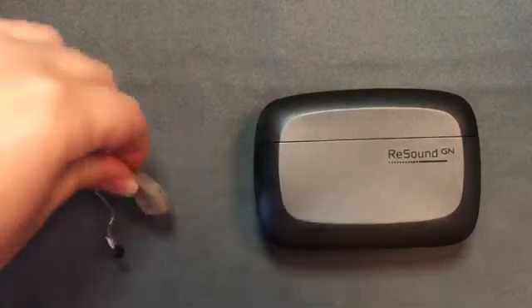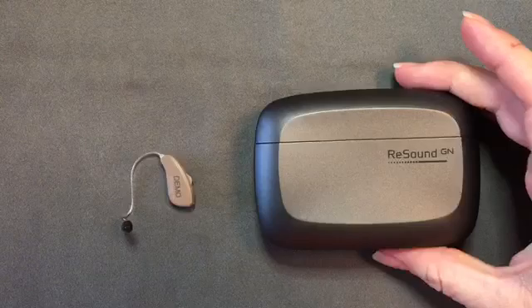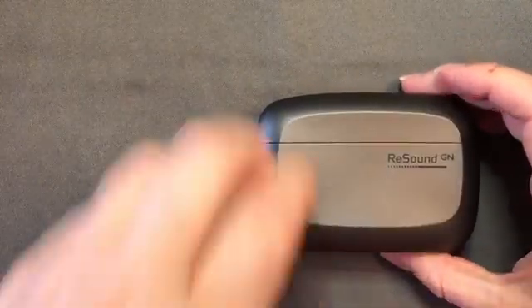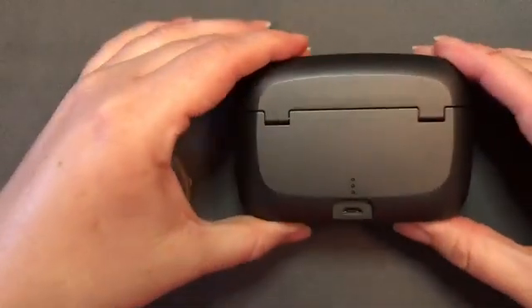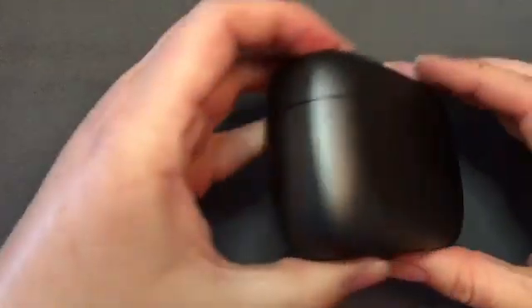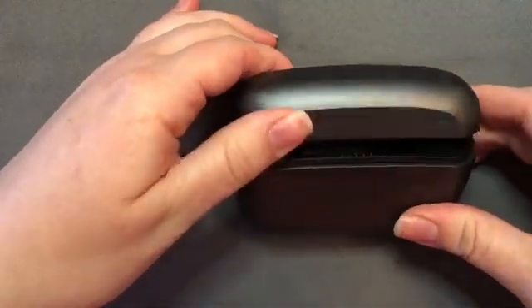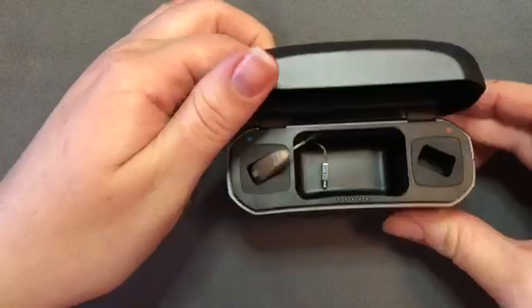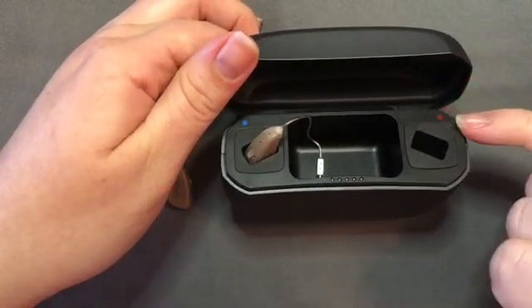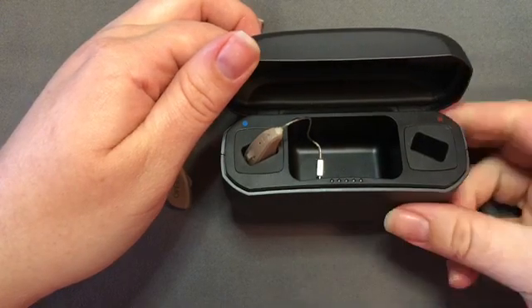There is no battery door on this style since the lithium-ion battery is fully encased in the hearing aid casing. We do, of course, have a charger. If we flip that over, there is a mini USB port on the back of the charger to plug the power cord into. If we open the top of the case, you'll see there are two charging ports — one for each hearing aid. These are color-coded red for the right ear and blue for the left ear.